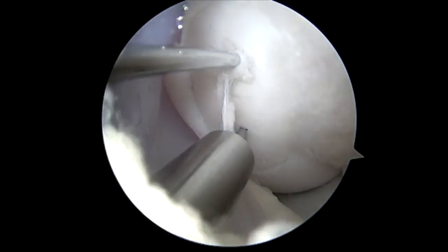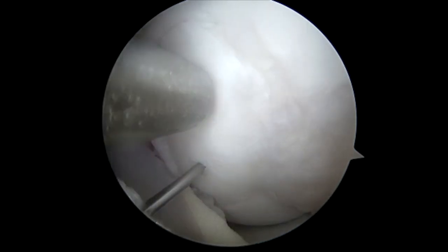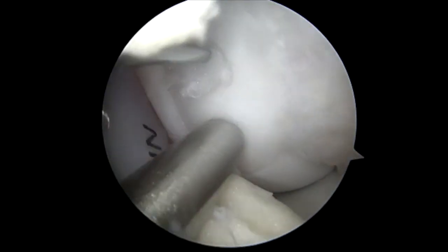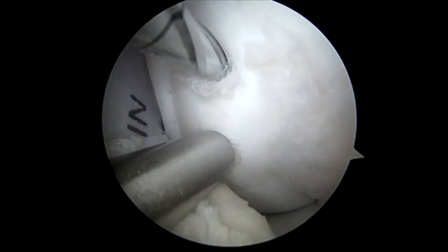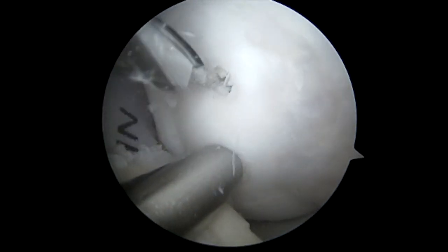We will use two screws here. Our goal is to penetrate roughly 22 to 26 millimeters in depth on the OCD. We're dilating again on the superior wire to ease drilling and entry of the screw. We also dilate the inferior wire as well. Entering the drill, we drill roughly 12 millimeters in depth, just to pop the far cortex, keeping counter pressure with the dilator. We remove this on oscillation so as not to pull out the wire.